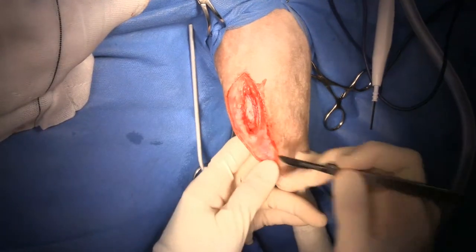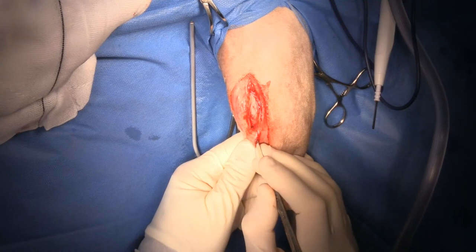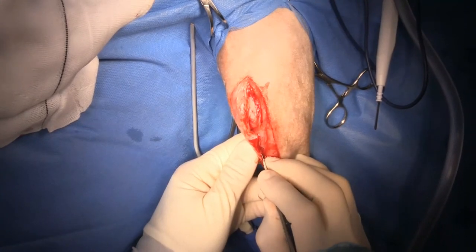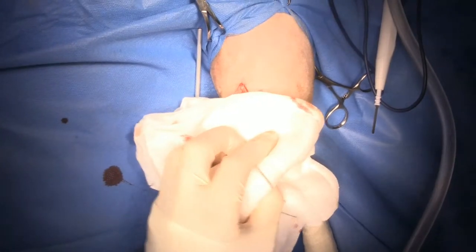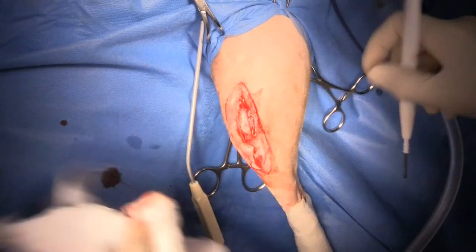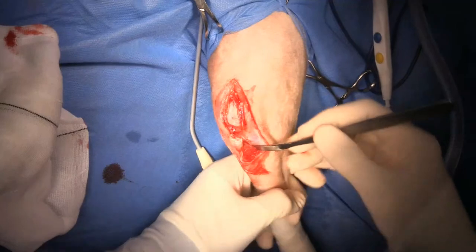Now I'm going to cut and extend my incision through the fascia overlying the cranial tibial muscle, and I'll put a Hohmann retractor behind the cranial tibial muscle to expose that surface.